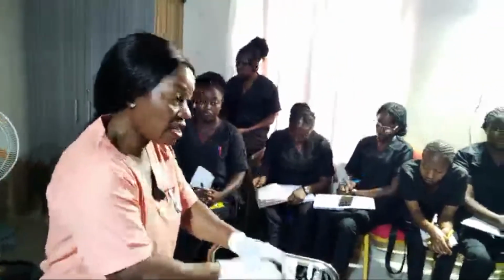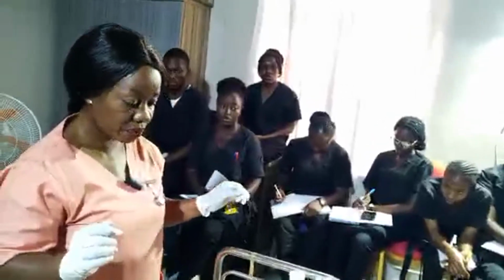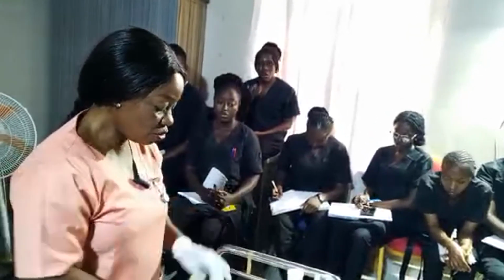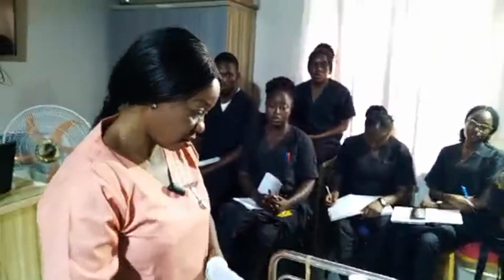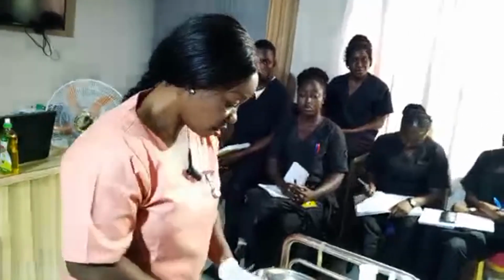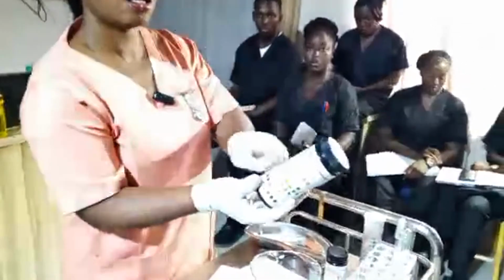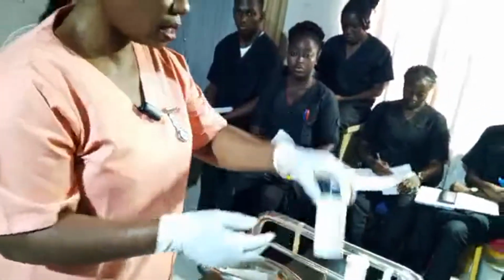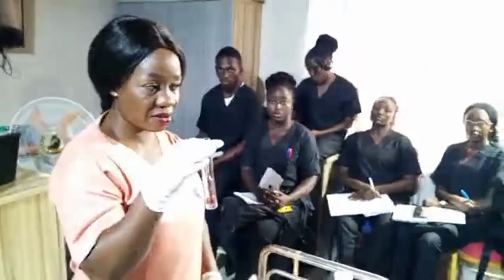So the next step now is for us to know, since we have our pH here, we can use this Combi 9 test strip and take our pH, and then we want to know our specific gravity. So I will do this last because I will contaminate my hand.